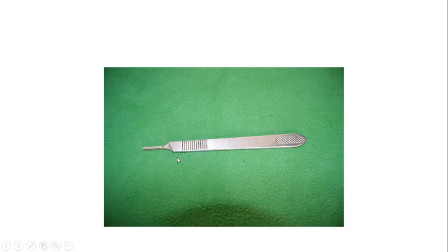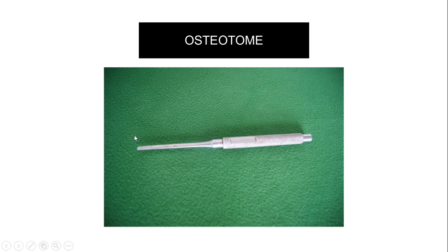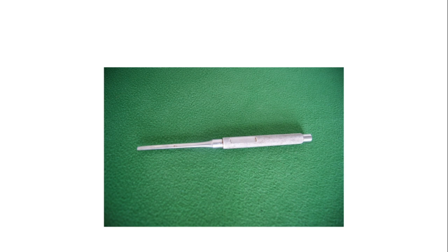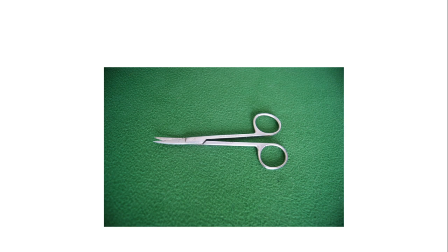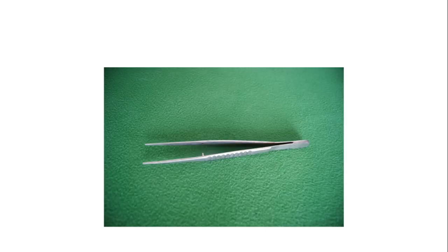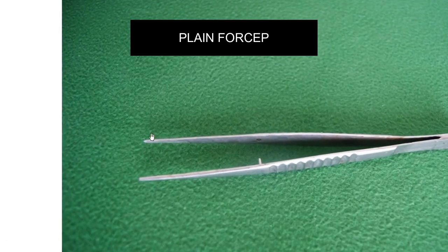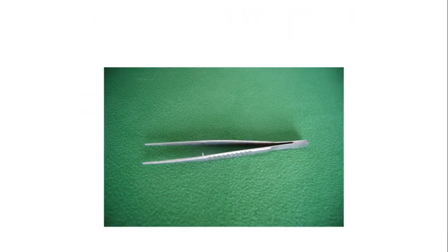This is the trocar. Its most important use is in Caldwell-Luc operation, where a small opening is made in the canine fossa. It is used to make small openings, for example in antrostomy. This is the fine tissue forceps — a plain forceps. As you can see, there is no tooth-like projection, so it should be differentiated from tooth forceps. Both types are used for holding tissue.